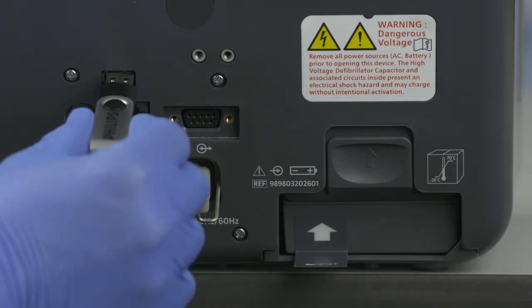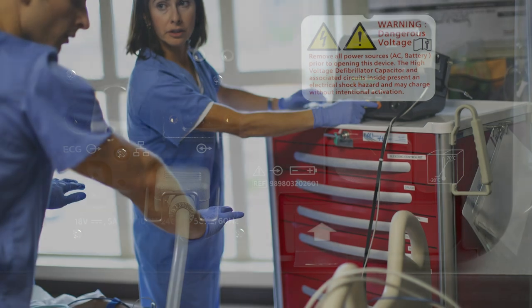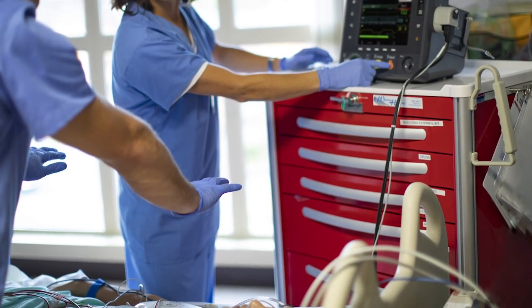During a critical event, the HeartStart Intrepid can transmit 12-lead ECGs and vital signs to a remote location via Wi-Fi or cellular transmission. In addition, the device automatically stores event data from all four modes of operation, which can be transferred to a USB drive for upload to a data management application or transmitted to Philips' cloud-based IntelliSpace Connect data management solution.